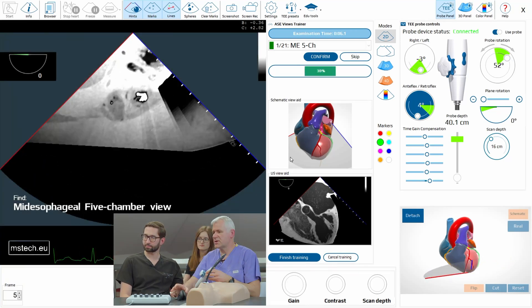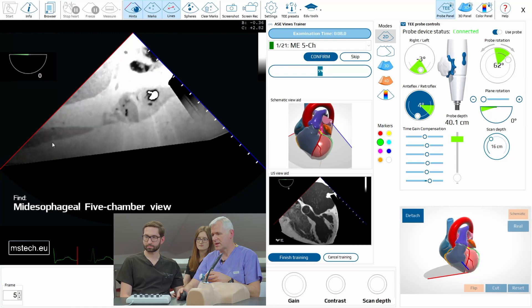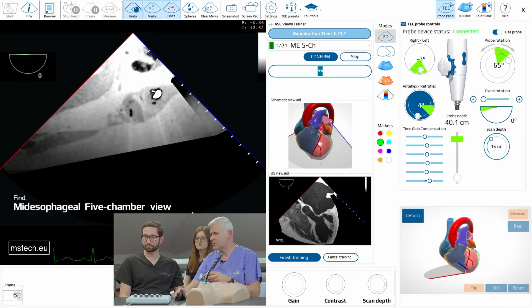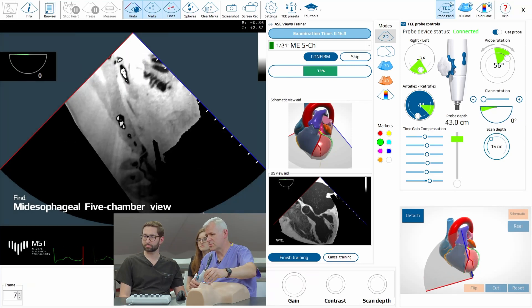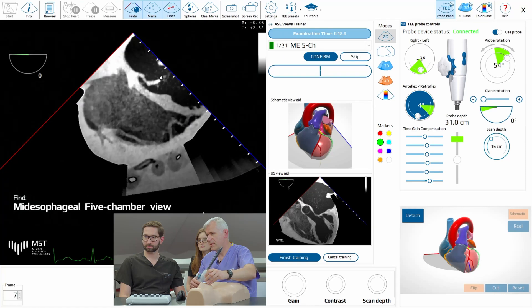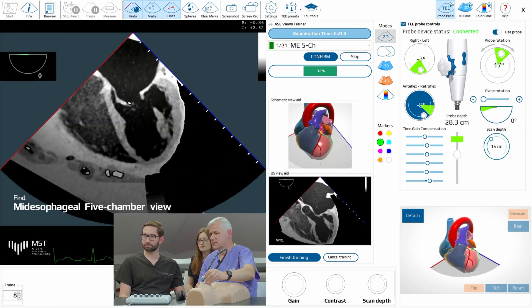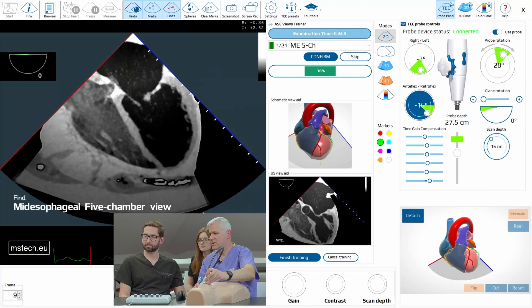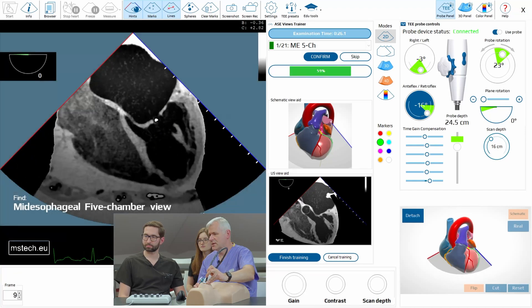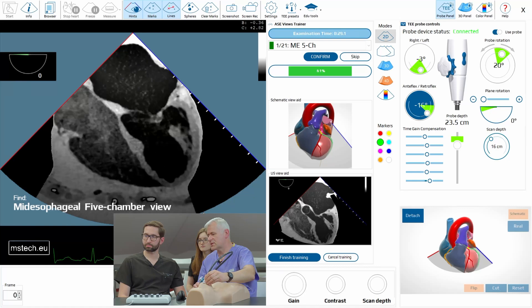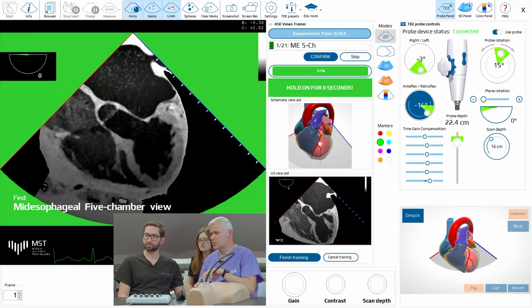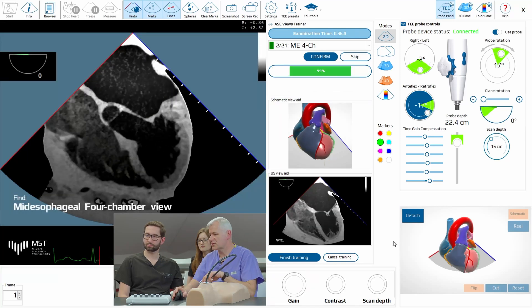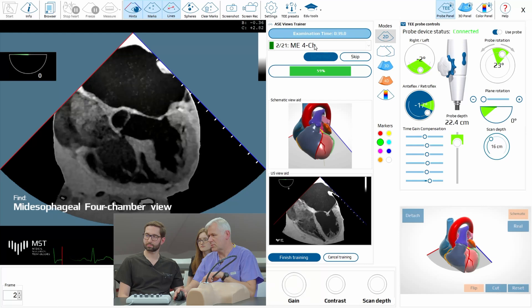The machine gives you the task, which is to find the mid-esophageal five-chamber view. We haven't really discussed the five-chamber view yet, but it's very similar to four-chamber. I'm just pulling it back — you see this is four-chamber, and if I pull a little bit higher the background is getting blue. And if I go to the view I'm supposed to obtain, it goes green. So the machine automatically says this is good.